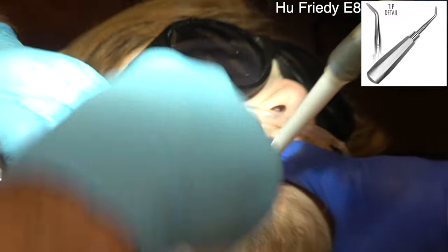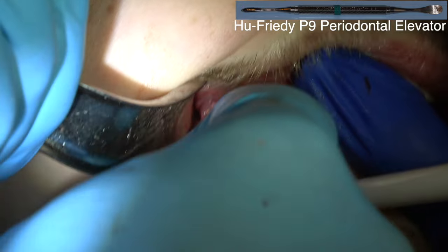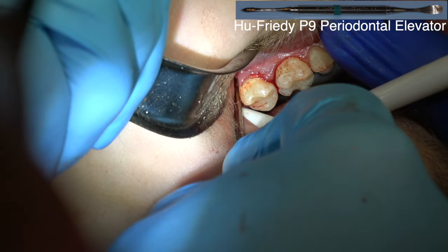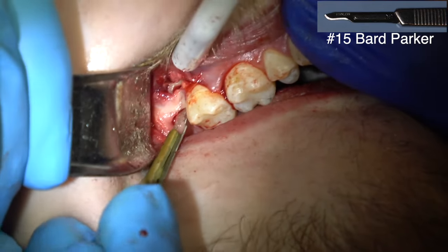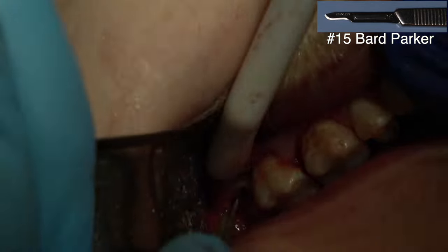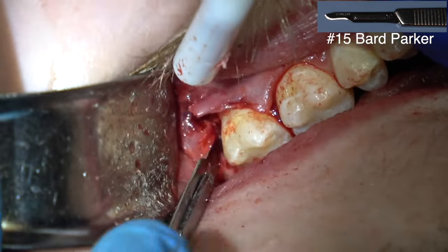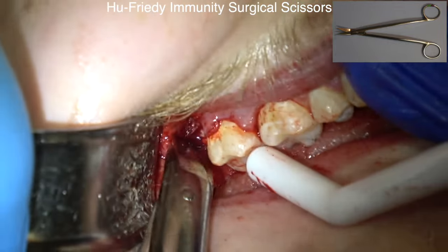You can see the tooth. Those fully formed roots make impacted wisdom teeth twice as hard as they would normally be. In the tip, that root's so long it's wedging against the apical part of the second molar, and then the bone distal to the coronal part of the wisdom tooth — so it's just in a bind. You've got to create some space so you can get it up and out.